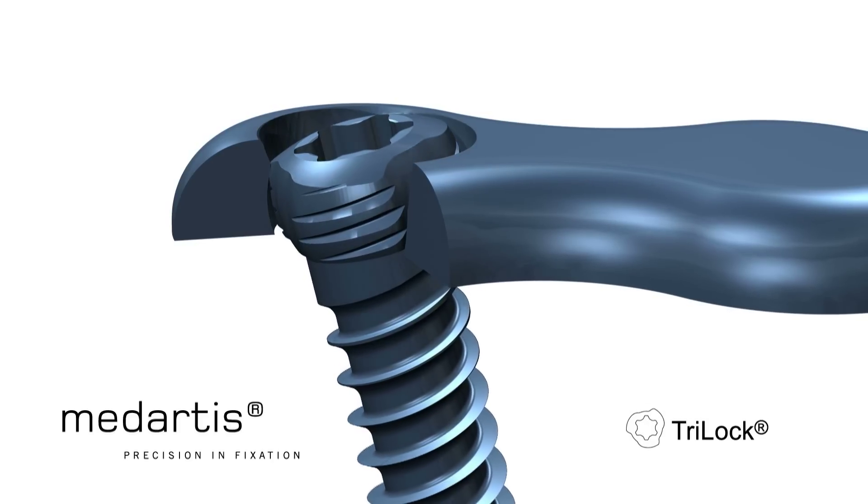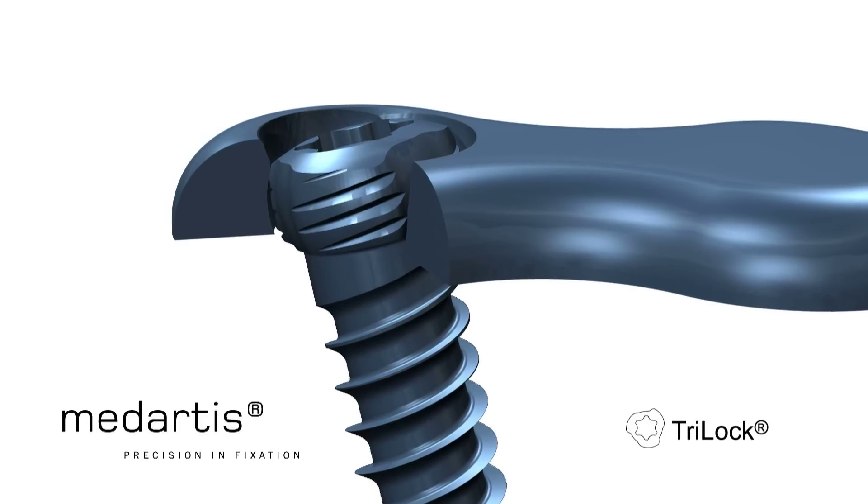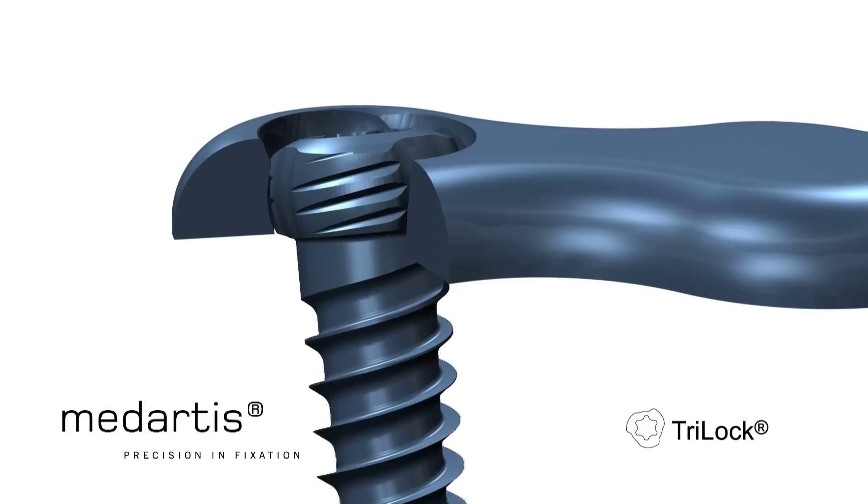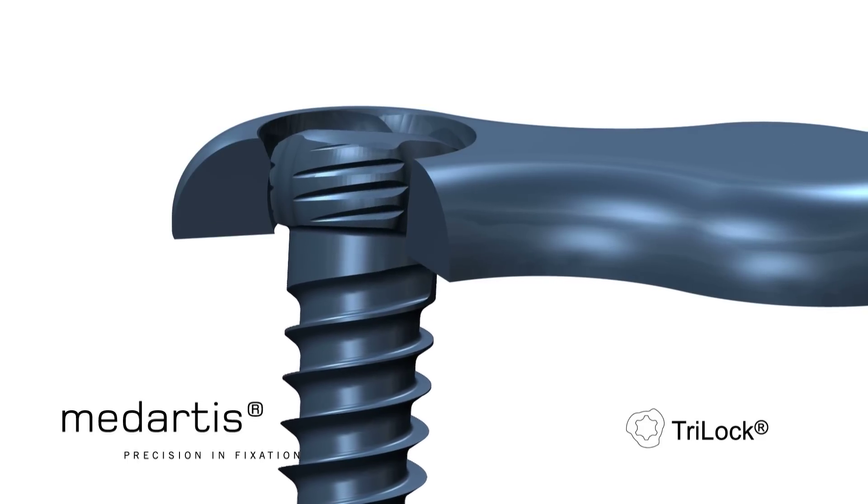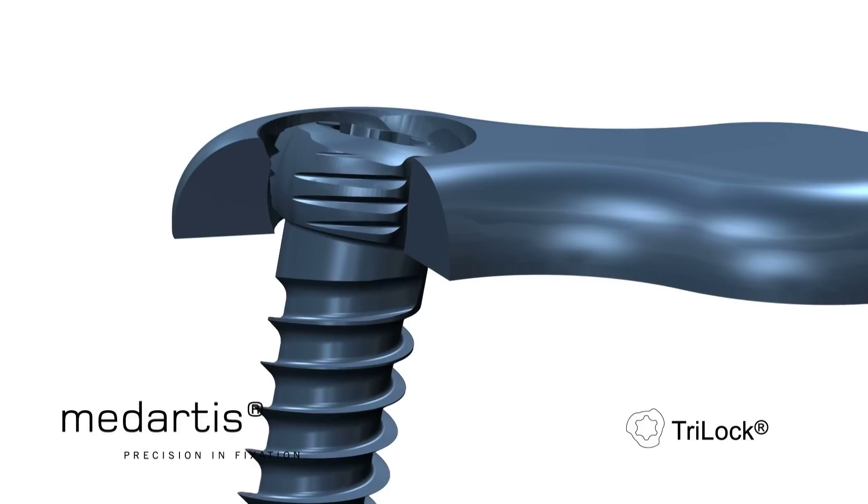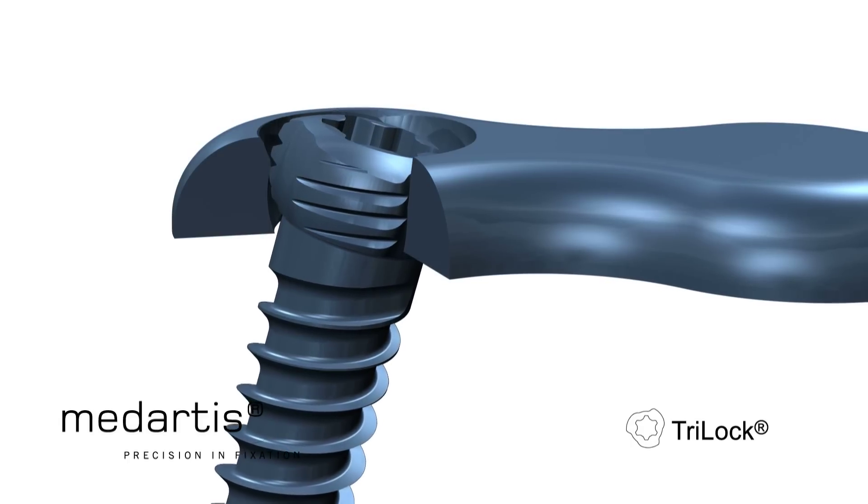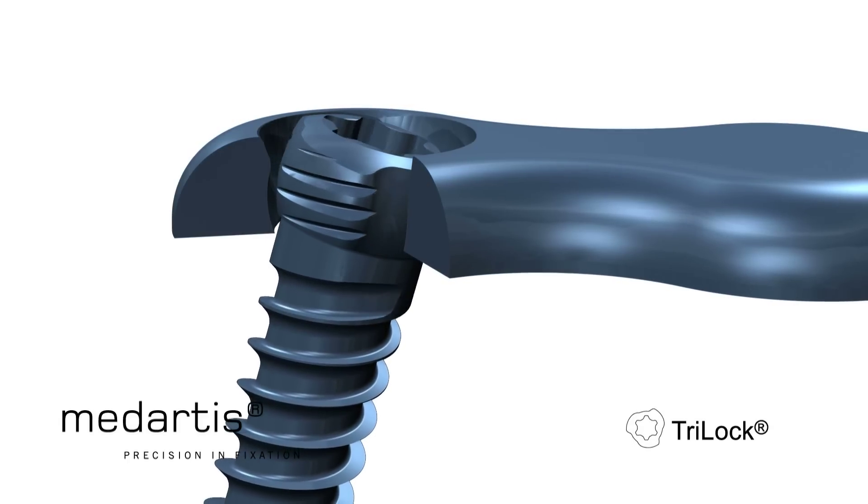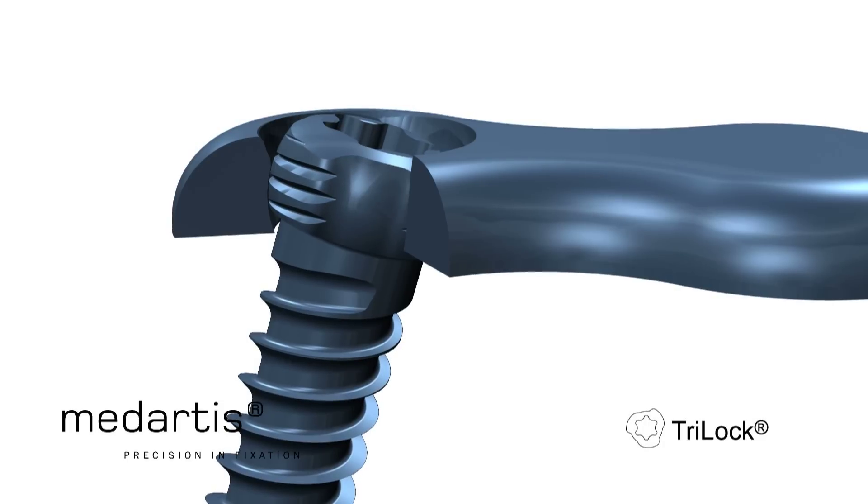The Medartis Tri-Lock solution does not require any kind of thread, which is either already integrated in the plate hole or which is created by the screw during the locking process. Therefore, any angle can be chosen. There is no force vector that will push the screw from its chosen angle and position.